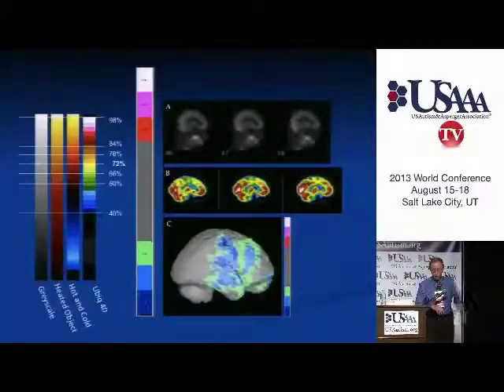over the years. In other words, we actually do know what is average brain blood flow, and that was determined over the last 30 to 40 years, and we incorporated that into the color scale that we use, such that when I talk to you about increased flow, increased function, the multicolor scale actually has some known physiologic meaning. Not all the color scales that are used on scan pictures actually have a known physiologic meaning. That's not bad, it's just something you need to know.